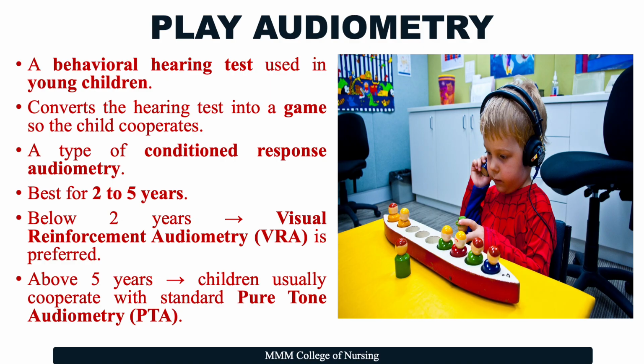Next is play audiometry. It is a behavioral hearing test used in young children. It converts the hearing test into a game so that the child cooperates. It is a type of conditioned response audiometry. The principle in this is children may not respond reliably to normal pure tone audiometry. In play audiometry, the child is trained to perform a play activity like dropping a block, stacking rings, or placing pegs every time they hear a sound. So this makes testing fun and keeps the attention.